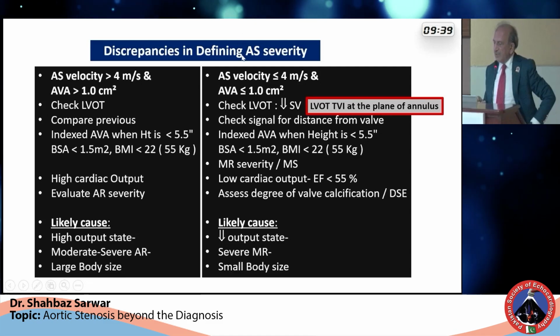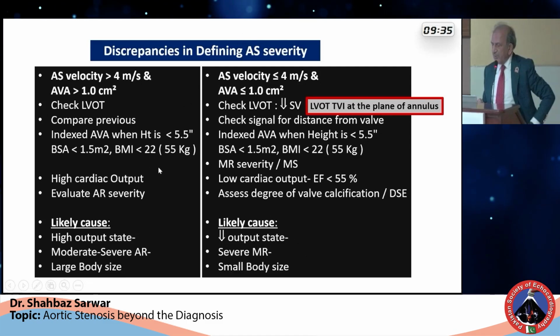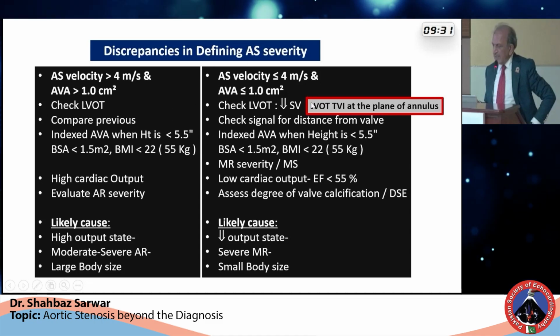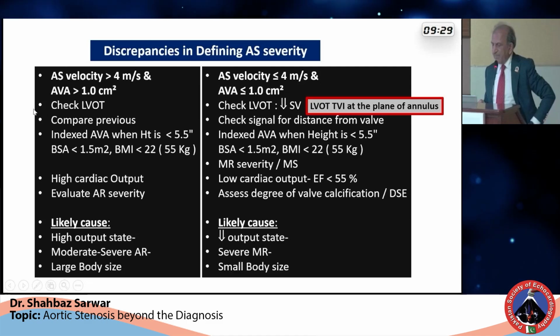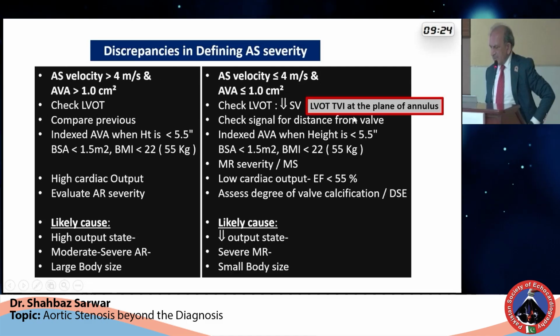We have either gone beyond that or below that. So measure the velocity properly, and how to do that we'll discuss later. And measure the TVI at the same plane. Then compare with the previous echoes. Check the signal from distance. That is the same thing.